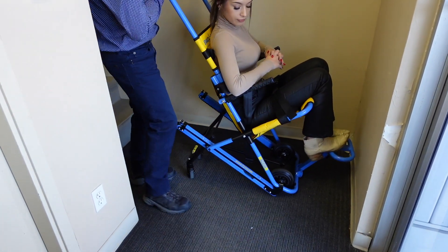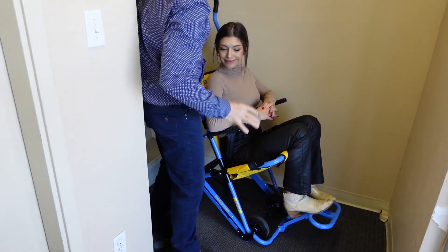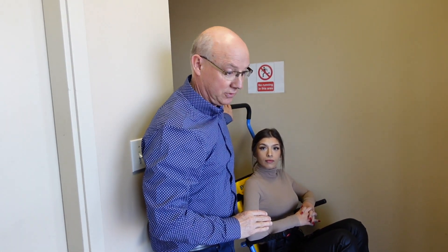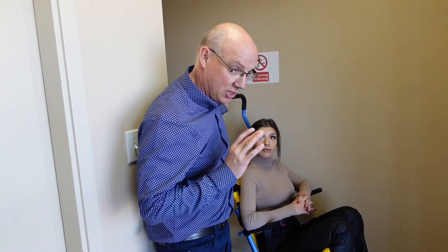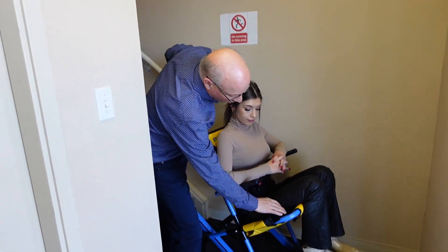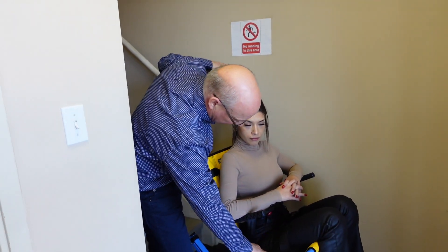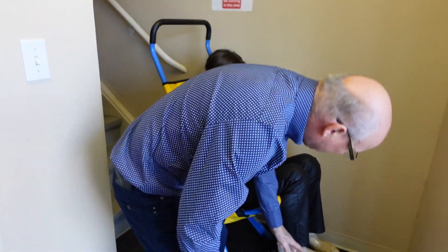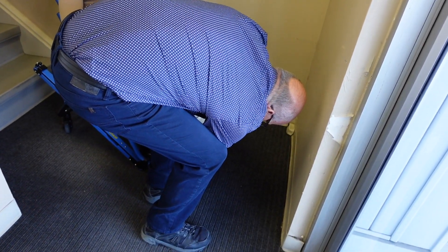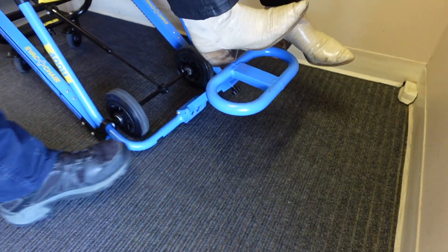So it's quite popular. This is the EVAC 400. The 400 weighs 33 pounds and carries 440 pounds, so you've got a pretty good range of weight capacity. The seat is a sort of hammock seat - Kim says it's super comfortable. And the footrest is adjustable - you can bring it up or bring it down for different clients. So that is the EVAC 400.